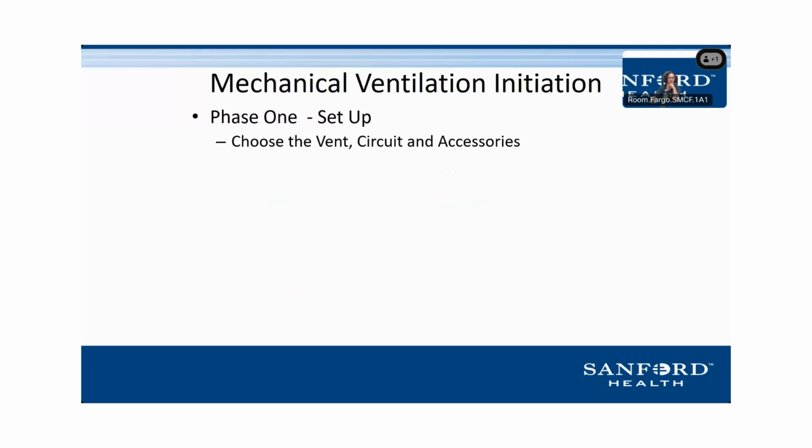And then on top of that, the end-tidal CO2 monitoring adapter that we put in line. There is a pediatric and a neonatal size as well. Ironically, it's to measure end-tidal, but the bigger the adapter that you put in line with the ventilator, the more rebreathing of CO2 that you're going to get. So make sure that you have the appropriate accessories to go with that ventilator.